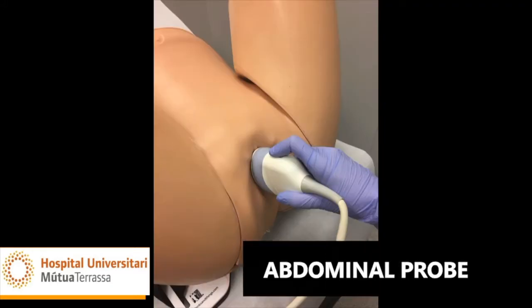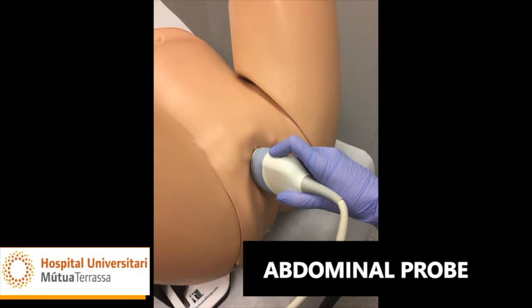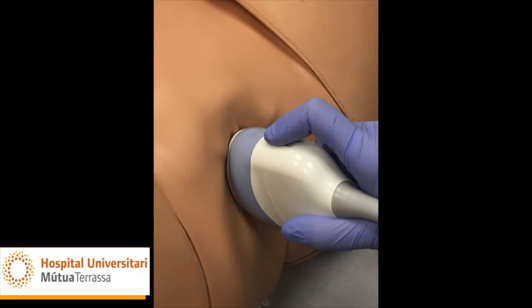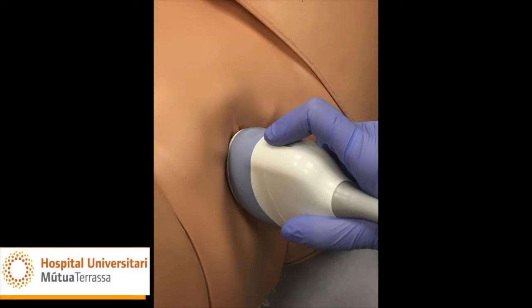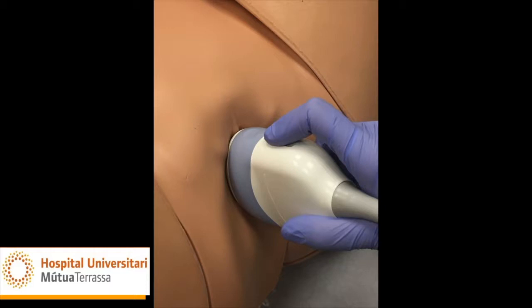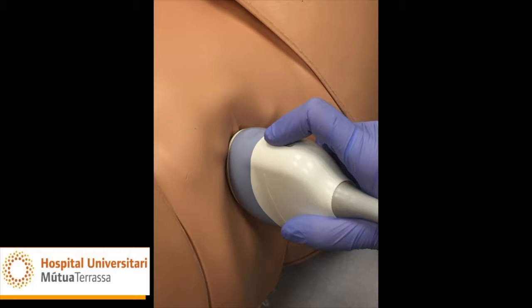The abdominal probe, used transpirineally, also allows 2D, 3D, and 4D ultrasound. It should be positioned in contact with the perineum between the labia majora. Although the resolution is a little lower than that of the transvaginal probe, it offers the advantages of having a greater depth of field and being suitable for use in cases of prolapse.